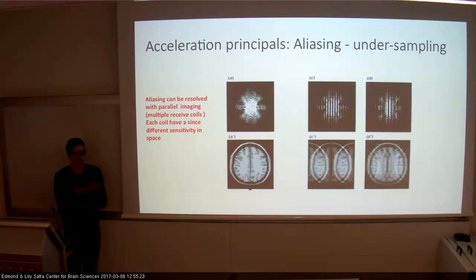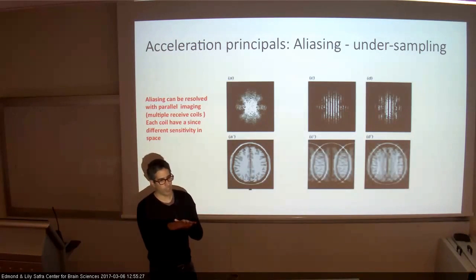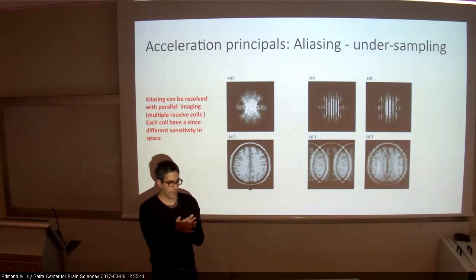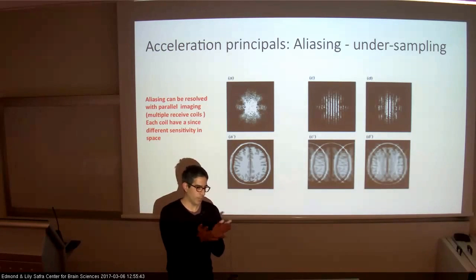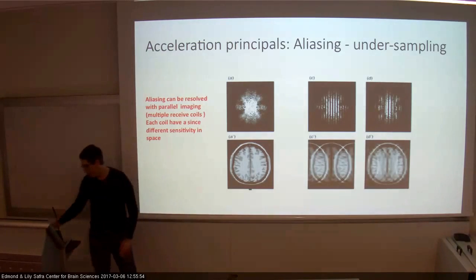Aliasing is like the image turning on itself. It means that you don't have enough frequencies to describe the full frequencies that exist in the image. For me, I just want you to understand that, given that we're working in K-space, there are people who try to accelerate this problem, making the measurements faster. We didn't explain it; we need a full class for that. There is a full field of work in engineering. That's the only thing to know here.